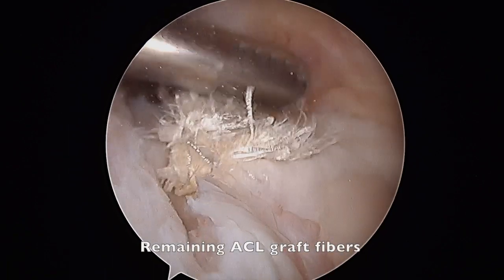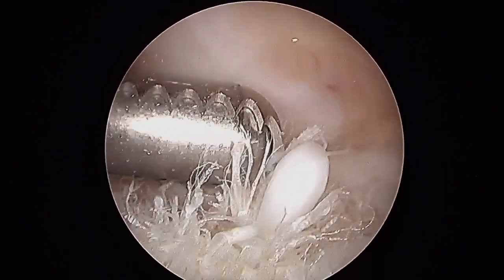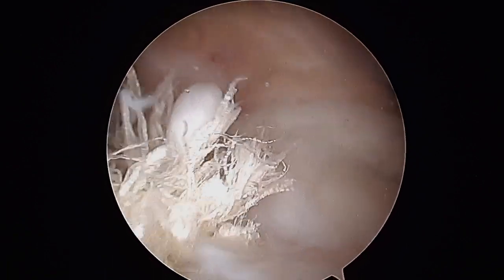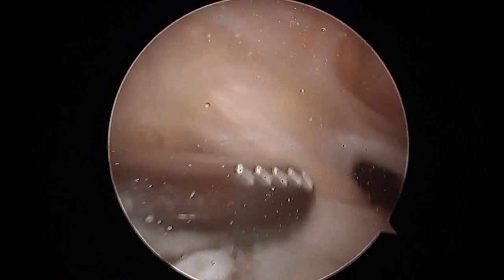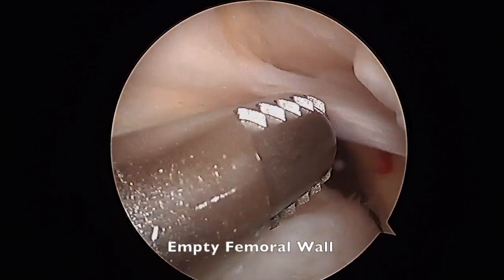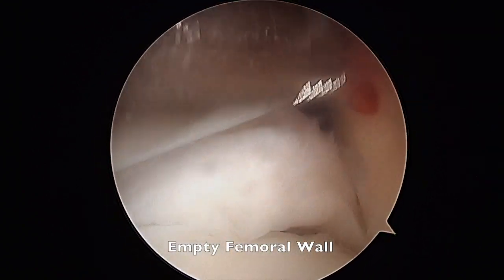This is an arthroscopic view of the left knee demonstrating failure of the ACL graft and absence of any ACL graft material within the femoral notch.